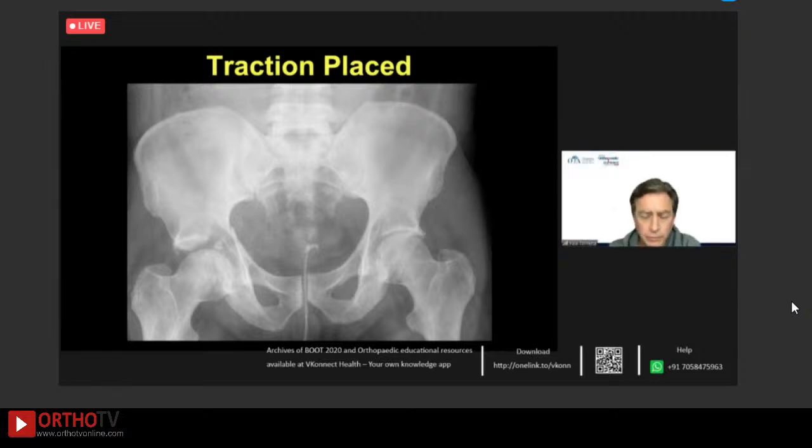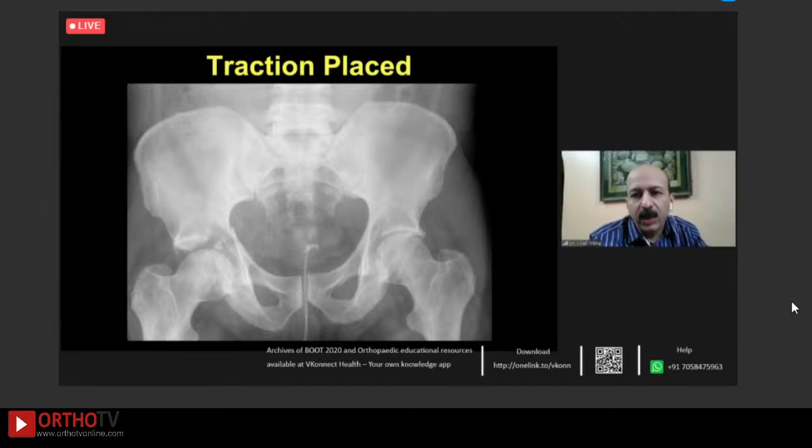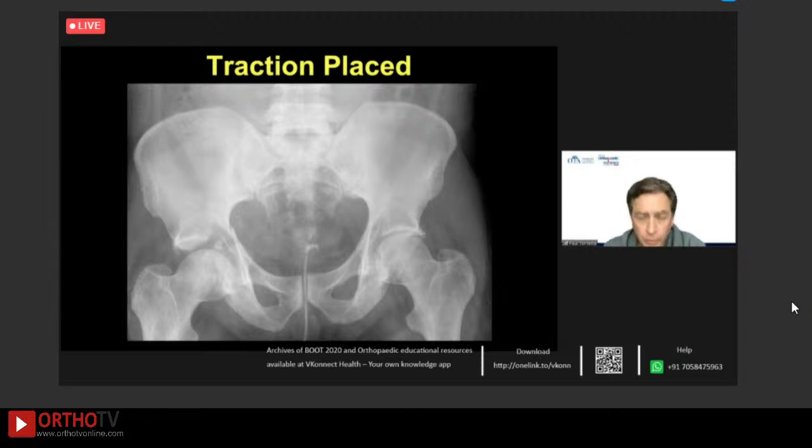And then I can put in my plate, as I showed in my talk also, and fire in two screws from the anterior to the posterior one after getting it reduced with a collinear clamp, maybe.